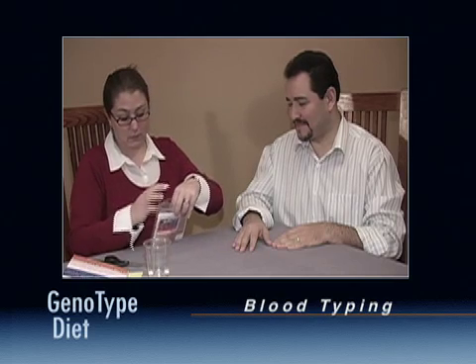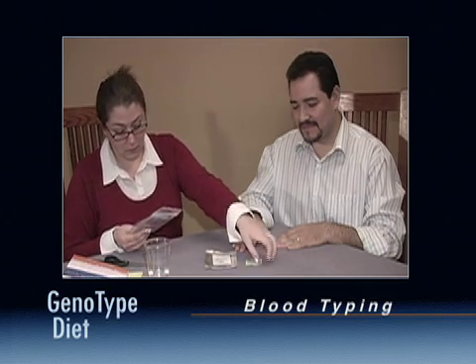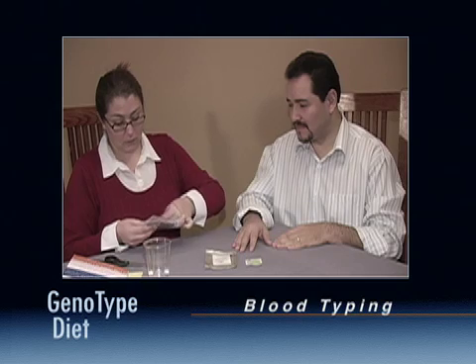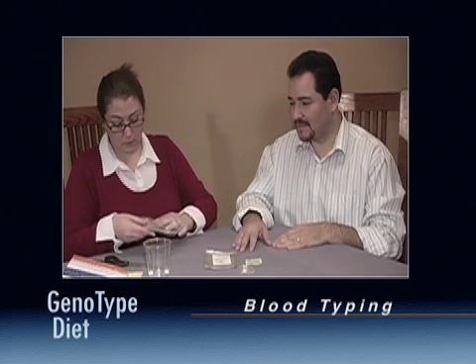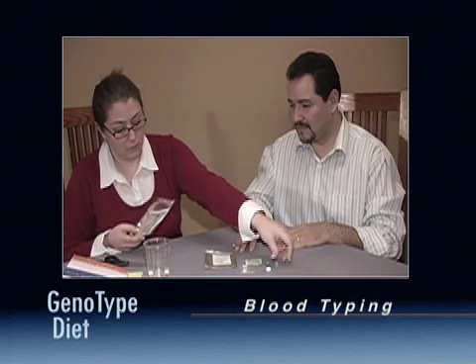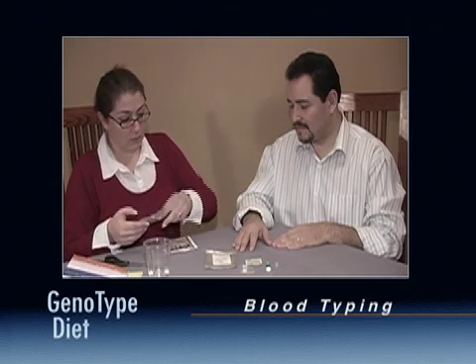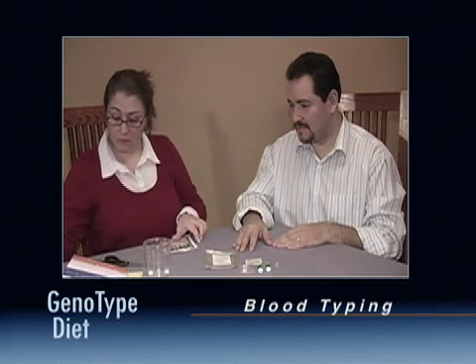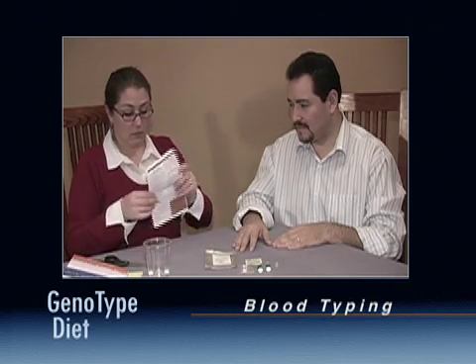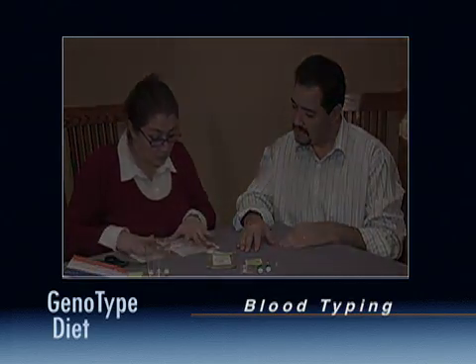If you wish to save the card, let it dry completely and store it in the foil envelope. Make sure that you dispose of all materials in a safe manner. For more information on blood type and its role in health and diet, refer to pages 37 to 38 in the Genotype Diet book.